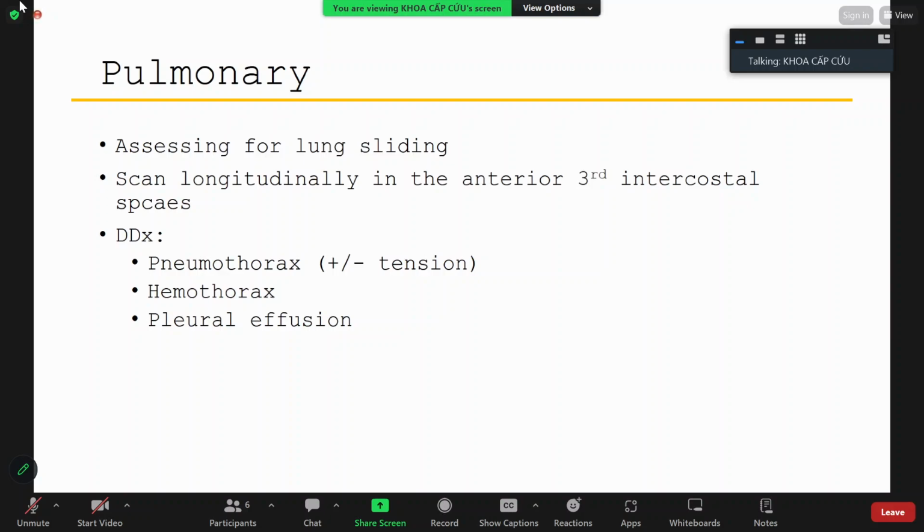But really what we're looking for, I think, is the pneumothorax or hemothorax or big pleural effusion that's causing tension physiology. Is that pathology bad enough to where it's compressing the IVC and inhibiting venous return back to the right atrium? And then it's always nice once you find this to confirm that with a stat or a quick chest x-ray.